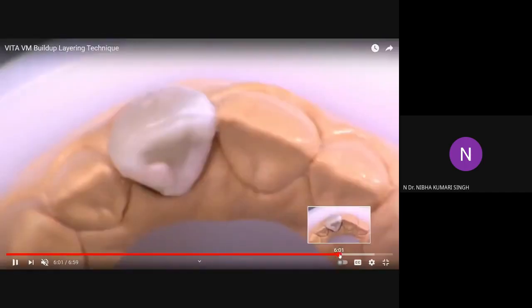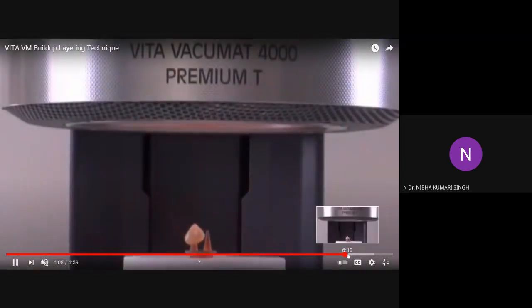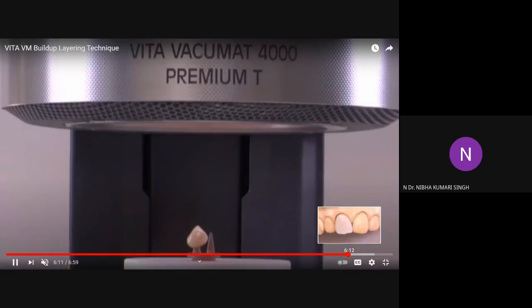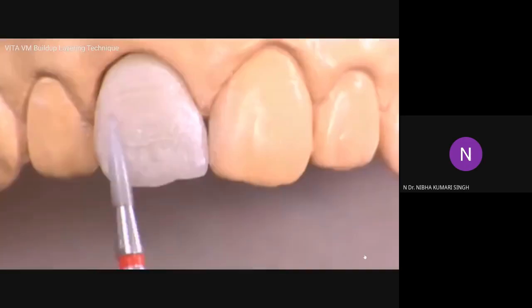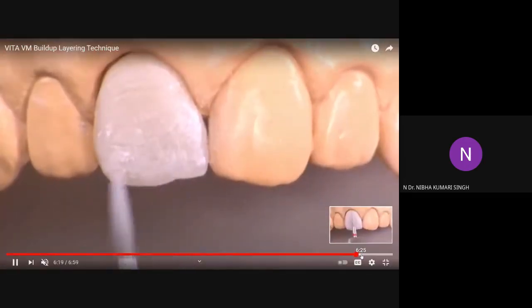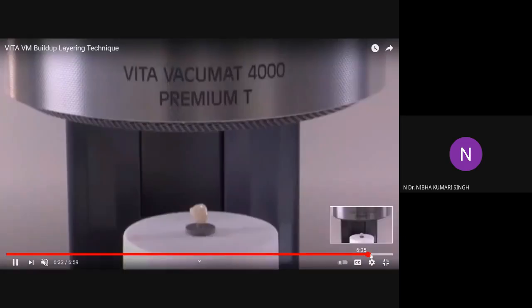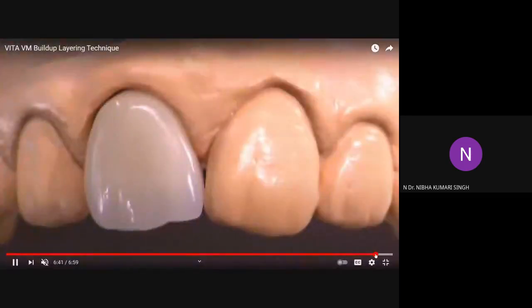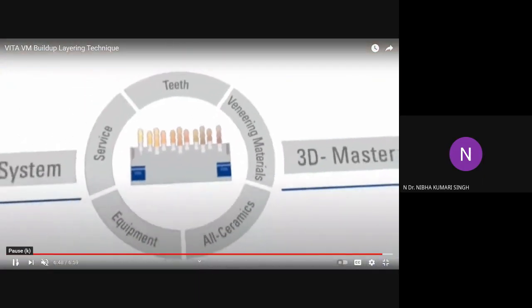Next, again they have applied the glaze and kept it for firing. Still you can see little pores are there. So they have ground the surface and then finally applied the glaze. 2 to 3 firing cycles. After the glaze, you can see it will be like a natural crown. So that is the advantage of your glaze, right? That's how your ceramic crown is produced, okay?